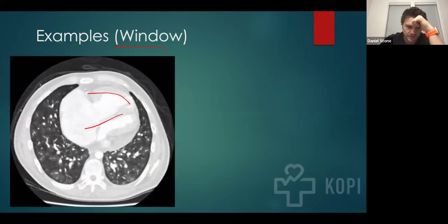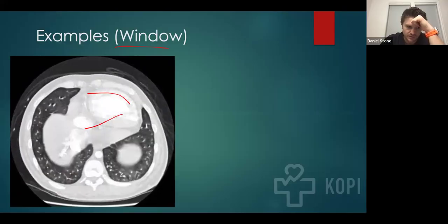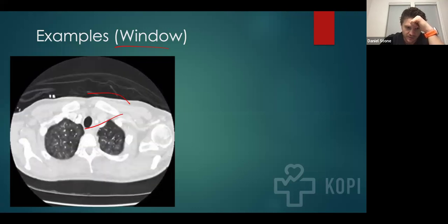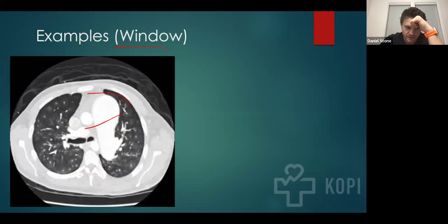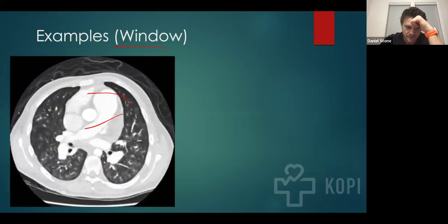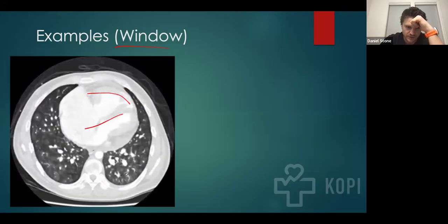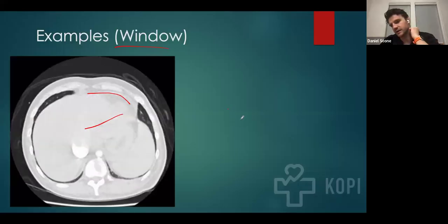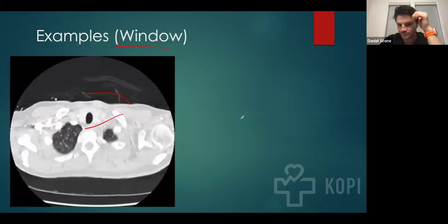I'll show you a little bit about what a normal lung field looks like, but there's fluid throughout all of the lung, and it looks symmetric. It also looks like it is worse centrally and then spreads peripherally. You can tell that it creates little pockets, and it's basically the fluid accumulating in the alveoli.